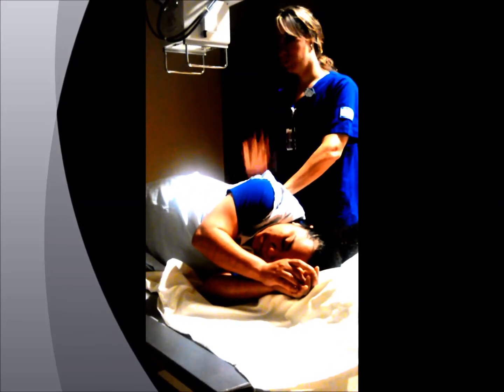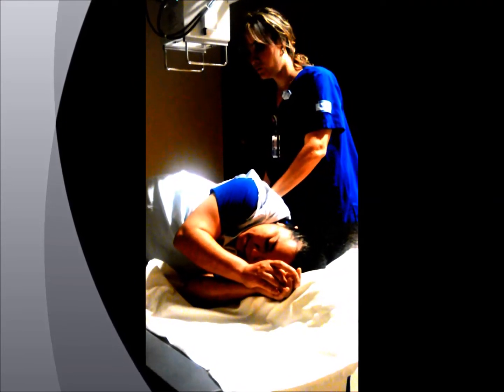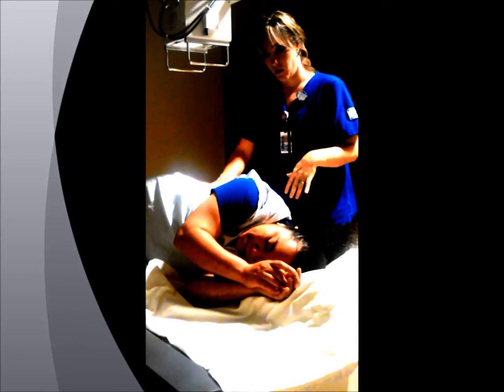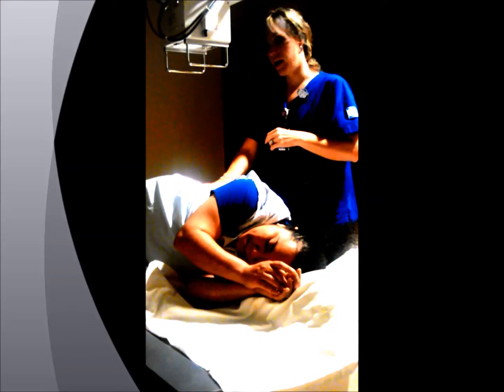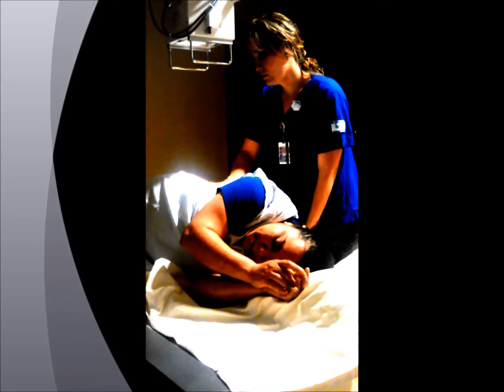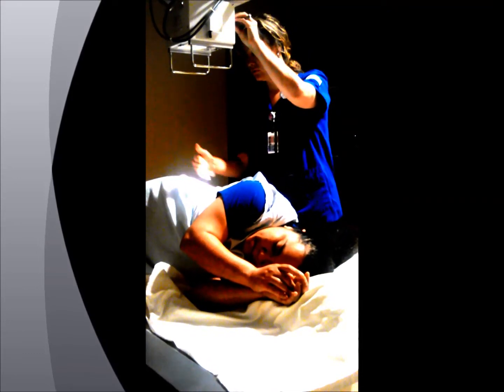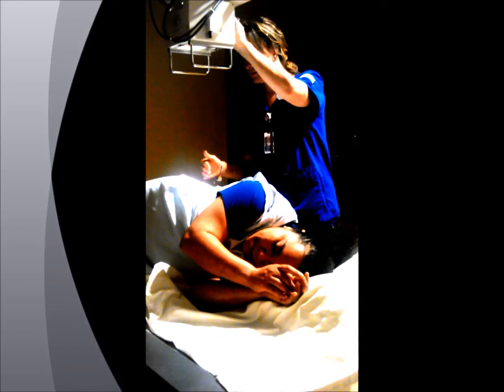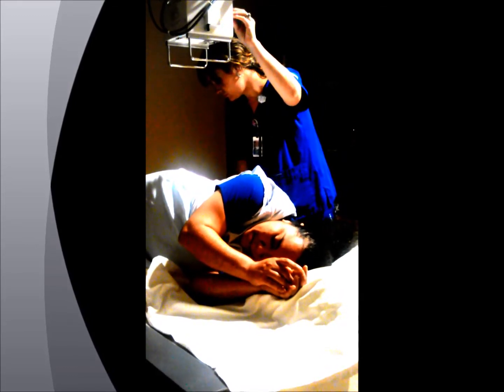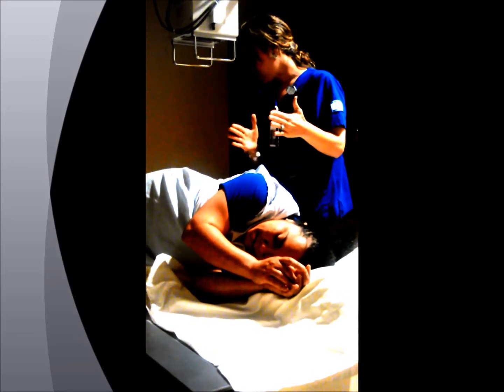So once your tube and your bucky are lined up, you just make a table from there. You're going to go mid-coronal, and because you're using the large IR, you're going to just center at your iliac crest, which is about here. And make sure you collimate on your lateral sides, to ensure the pelvis and your torso are in a true lateral.